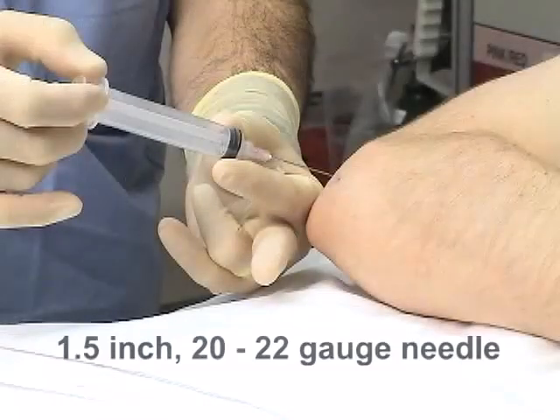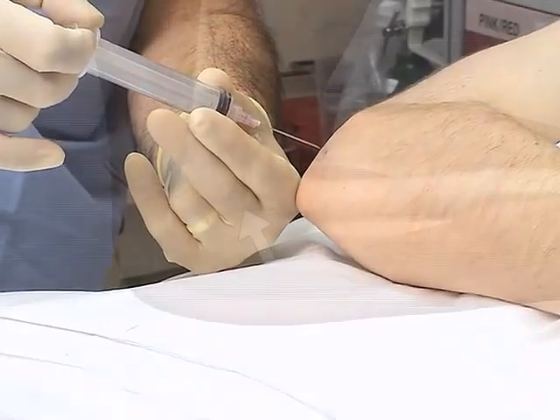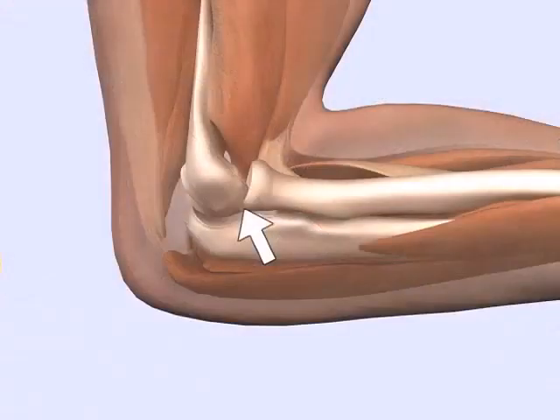Use a 1.5-inch, 20- or 22-gauge needle for aspiration of the elbow joint. Enter the skin in a perpendicular fashion at a point between the radial head, lateral epicondyle, and olecranon process.